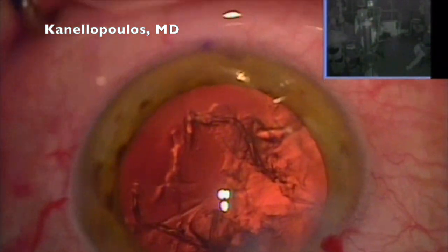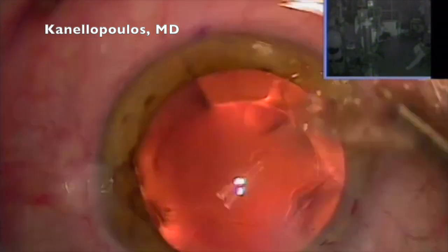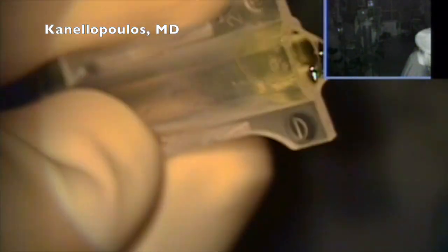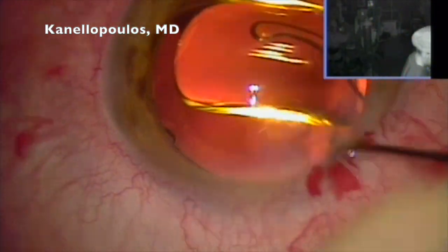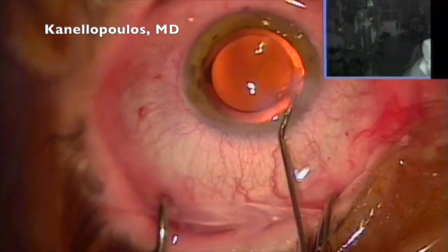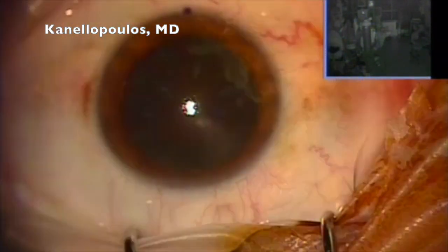Excellent stereo vision, excellent distance vision, by being very meticulous and vigorous in correcting astigmatism with the toricity of our lenses. This is not a blemish on the capsule. This is probably residual of the hyaloid artery placing in the lens. I was saying that we're able with blended vision to have better than 20/20 with both eyes at distance, and close to J2 at near, without compromising at all stereo vision and quality of vision that an EDOF or a multifocal lens would. But I know this is personal preference.